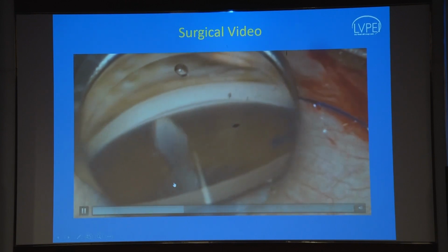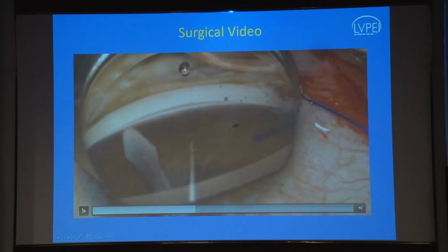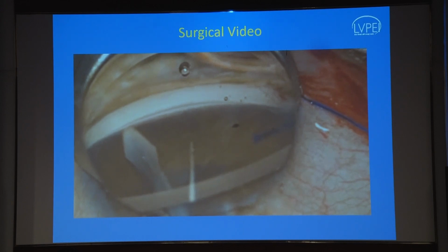So this is the initial goniotomy incision that we make with the MVR blade. Again, this is what I told about placing the suture inside. See, extraocularly the suture is here, whereas intraocularly the suture is here. If you place the lens first and then introduce the suture, the lens covers your side port. Through that opening you will not be able to, and you will be causing DMDs. So better is to place the suture inside, take your MVR also inside and keep it in the area of interest, then place the gonio lens, get a visualization of the angle, and then make your initial goniotomy incision.